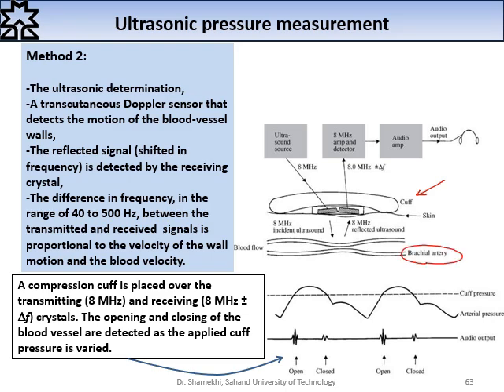The cuff will collapse the artery inside the body, and when the path of blood is blocked, we don't have any frequency shift between the received and transmitted ultrasonic waves.